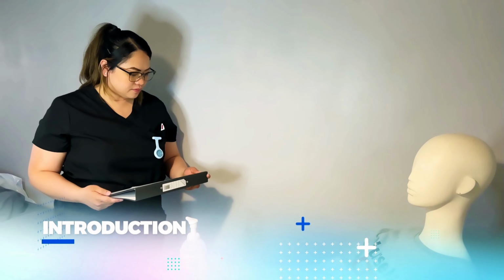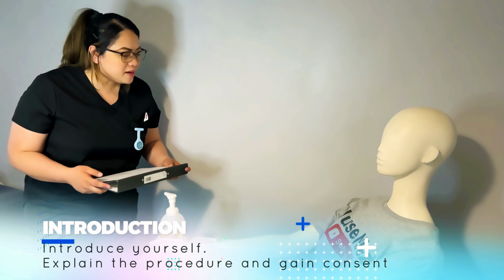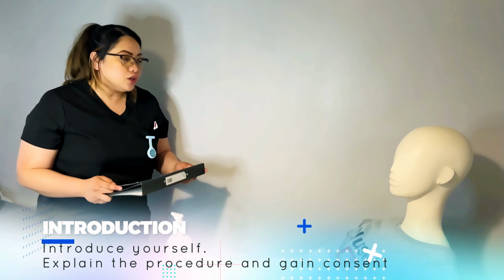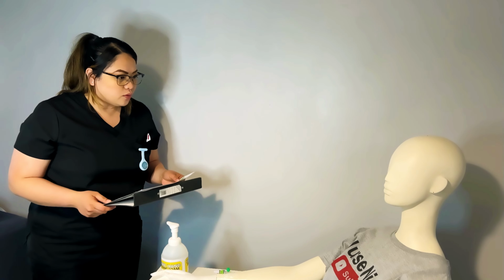Hi, I'm Nurse Cecile and I'm going to be your nurse for today. Hi, Nurse Cecile. How are you? I'm okay. Good. So I'm here today because I need to give you your subcutaneous injection. You're due with your insulin Levemir, so that's what I need to give you. If that's all right with you?